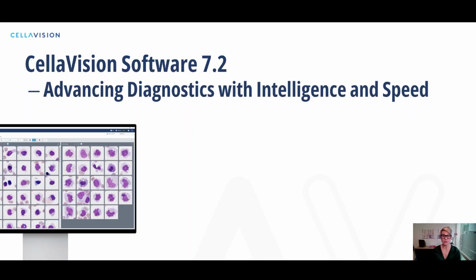In this new release, we are taking diagnostics to the next level by advancing both intelligence and speed. My name is Elina Bergskans and during this session I will walk you through some of the new features in software version 7.2. First, we are proud to introduce a significant leap in processing speed. The software now delivers impressive throughput when analyzing the slides.